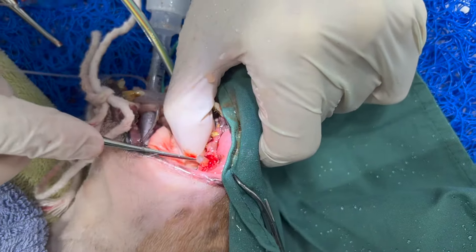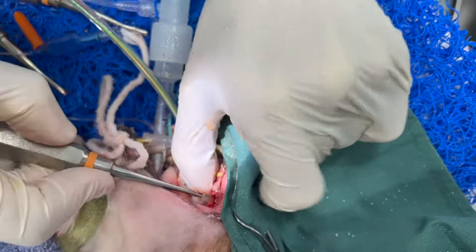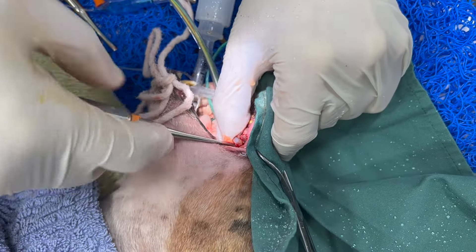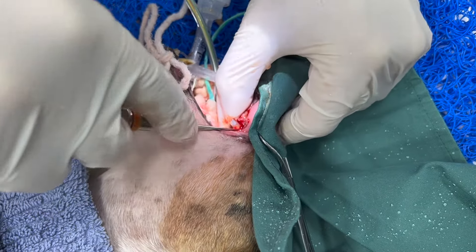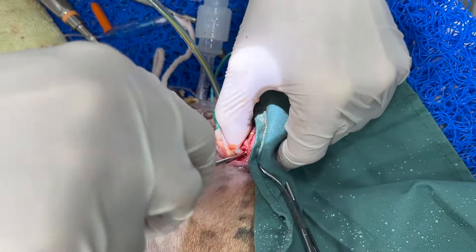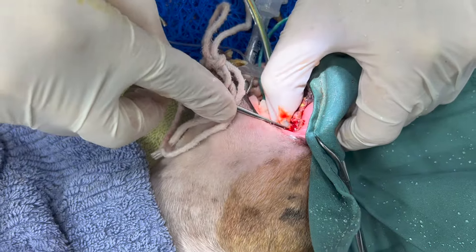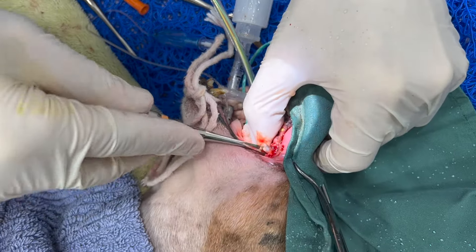You can see it's getting a little bit loose already. It's really important not to break the roots — our periosteal elevators are sharp. If you break a root, it's problematic; you want to try and take it all out. You don't want to leave a piece of root behind. That's why we spend about 20 minutes taking out teeth that have been abscessed for a long time — it's much easier than going back in later to remove a broken root.